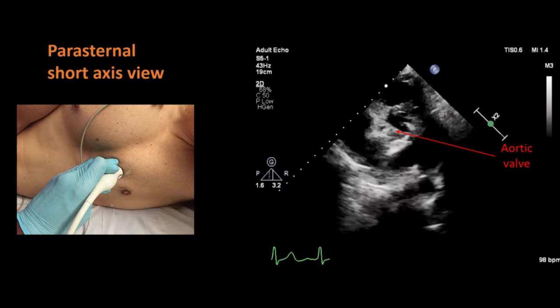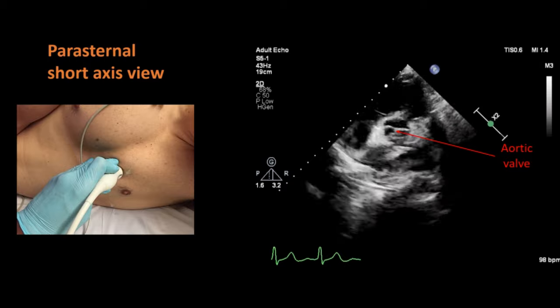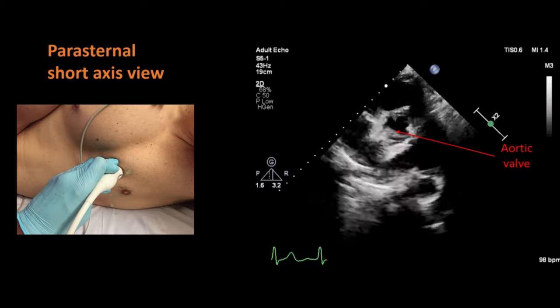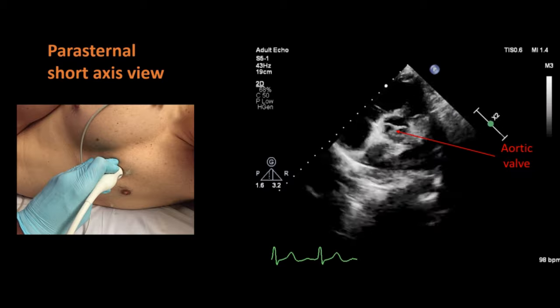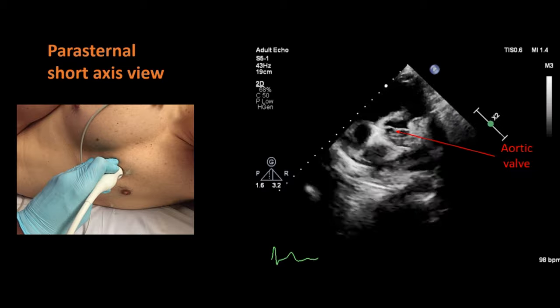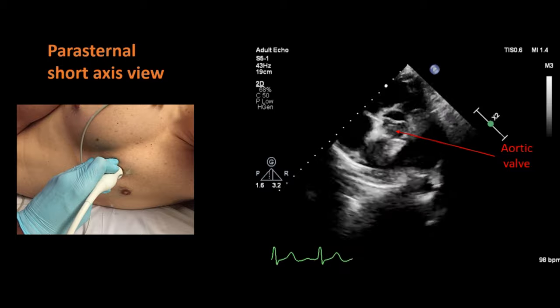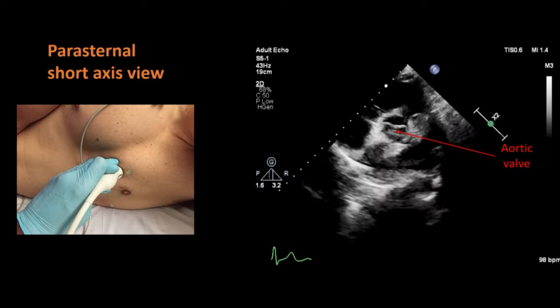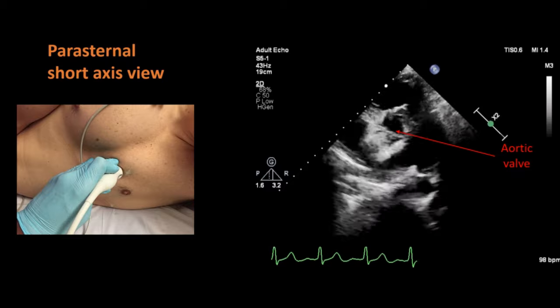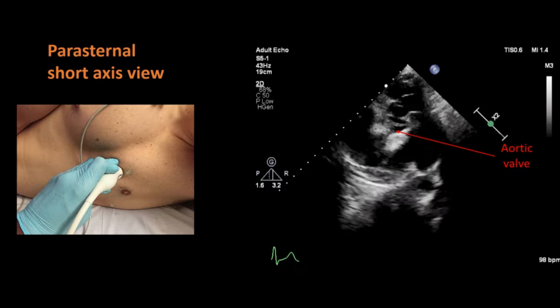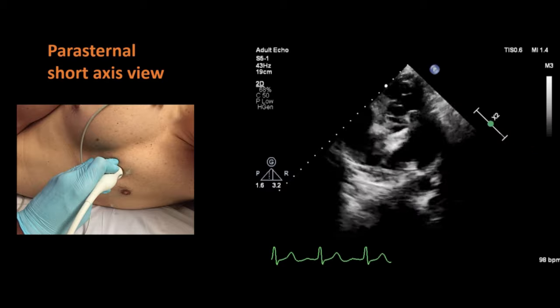With color Doppler, you can see pulmonary regurgitation if present. With continuous wave Doppler, you can measure the gradient at the pulmonary valve in cases of pulmonary stenosis to quantify its severity. This is the only view in which you shall be able to see all three cusps of the aortic valve. If only two cusps are present, it is known as a bicuspid aortic valve.